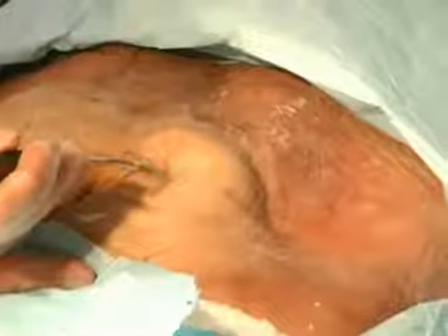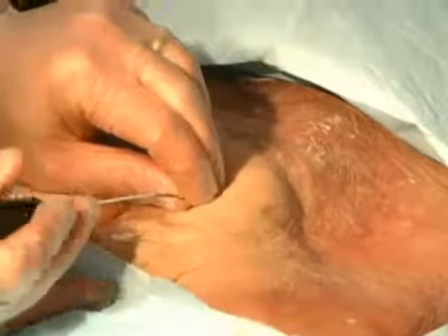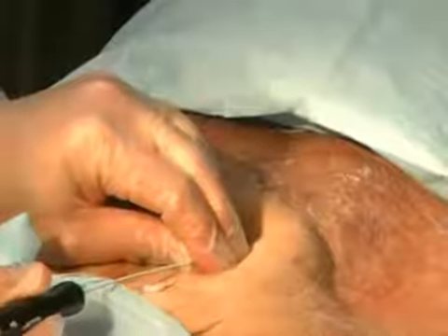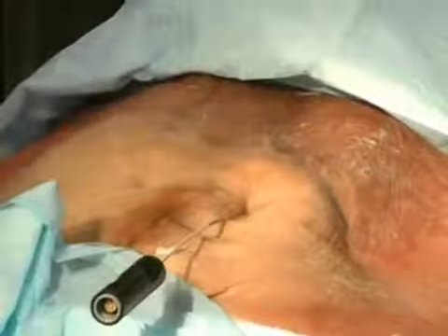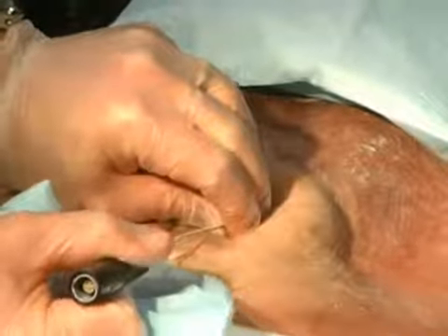So we're going to come down. John had suggested leaving the 25 gauge needle there because you know where the bone is, and I think that's a great idea. So I'm on periosteum right there. Now I can't obviously drive it because it's curving down. Thanks, John. I'm just watching this marker with the tape. I'm not turning it a lot unless I have to, but I want to get it to start to move along this line. So I'm just twisting it back and forth to see if I can get this to advance, so I stay in that line, but also stay in contact with the periosteum of the sacrum.